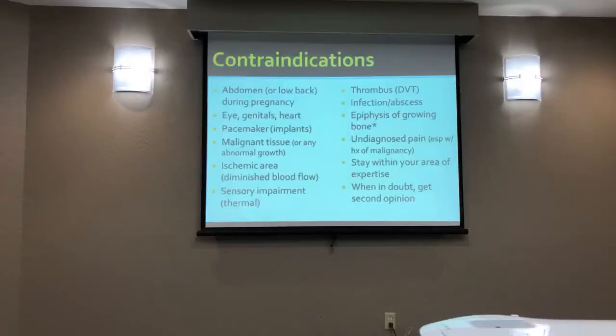Actually, I don't know if you went on that Electrotherapy on the Web site. I feel like that site also does a very similar thing, and it talks about the type of energy and how it can be deposited, and how even two similar treatments, not delivered over the same exact type of tissue that needed the treatment, would have a different outcome. And skin is not the same as a tendon. I agree. And there were some studies on animal models, and they're not new by any means, but some of them received ultrasound and some did not, and then they actually removed the tendon and compared it under a microscope. I think those are really interesting studies too, because they find that from a healing standpoint, the quality of the tissue is of different quality.